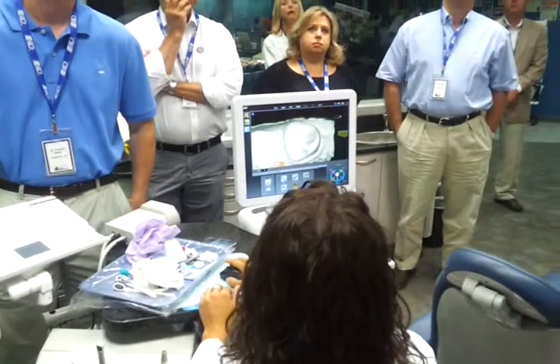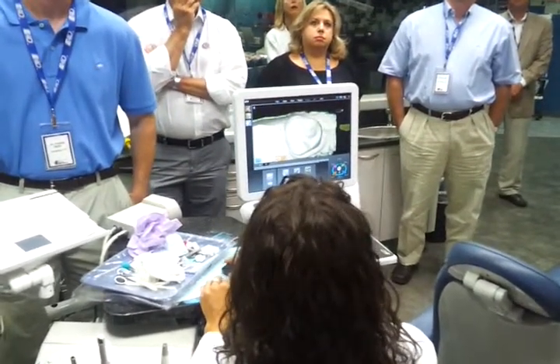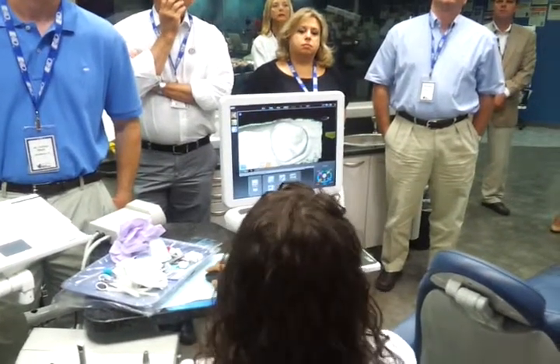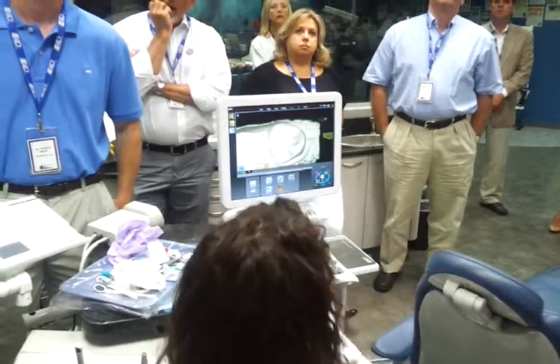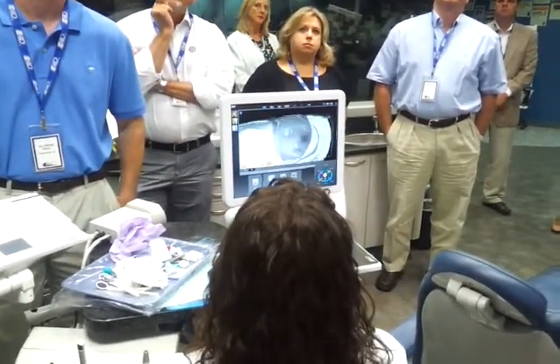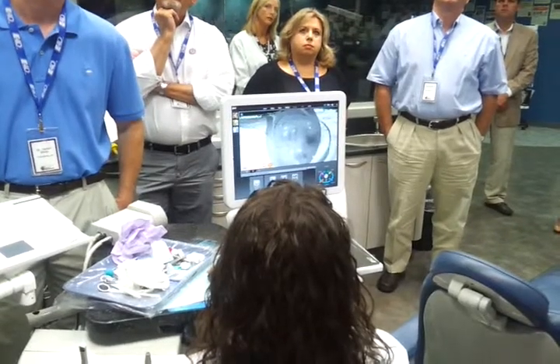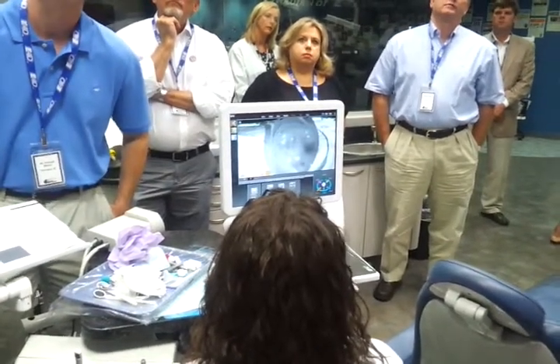A really cool tool that we have here, as you can kind of see in a proximal, I'm kind of losing my data, is ICE. ICE stands for I see everything. When I left click on the ICE button, it's going to take this stone layer off and it's going to show me my live view. So it's going to show me Gary's actual dentition. Now I can see live, alright, there's the edge of my enamel margin right there.